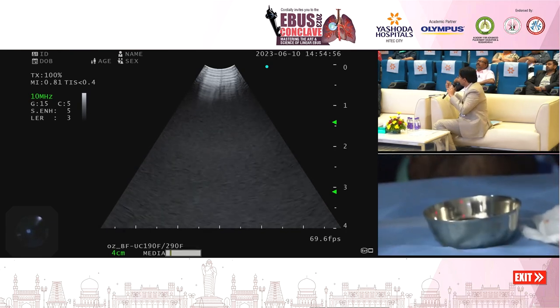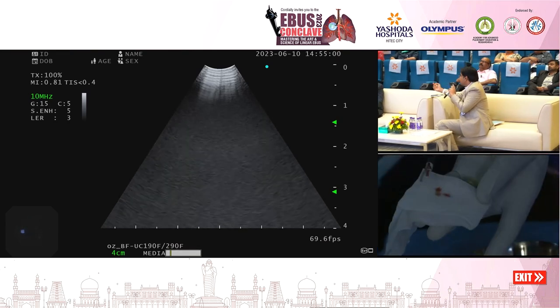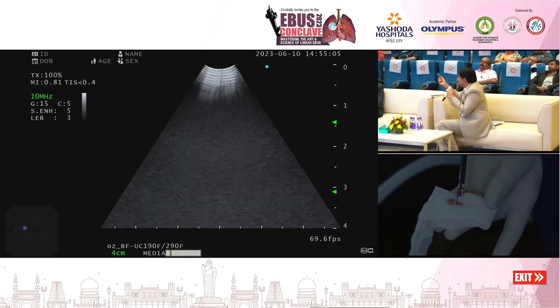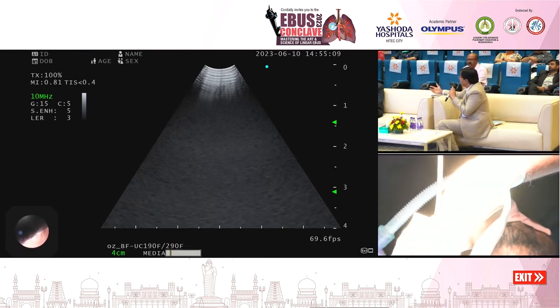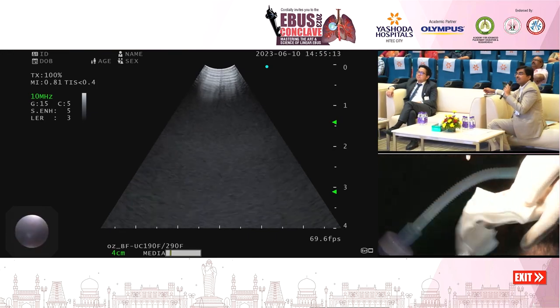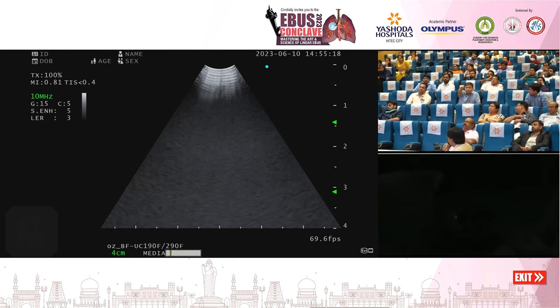So that is how we get a piece. It's usually around 2 to 4 millimeters. If you get anywhere between 2 to 4 pieces, you're almost getting a 1 centimeter long biopsy from the lymph node, which is very good for most diagnoses. Now generally we thaw it in saline and then fix it in formalin.